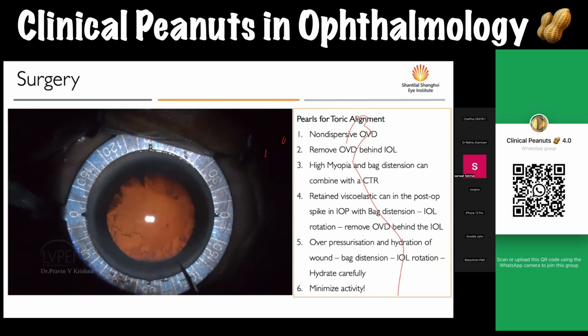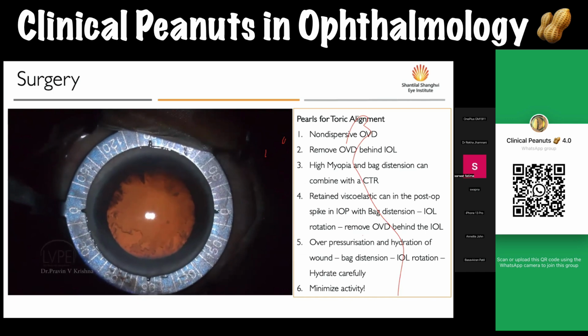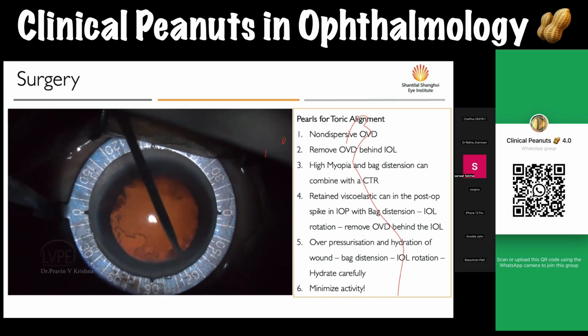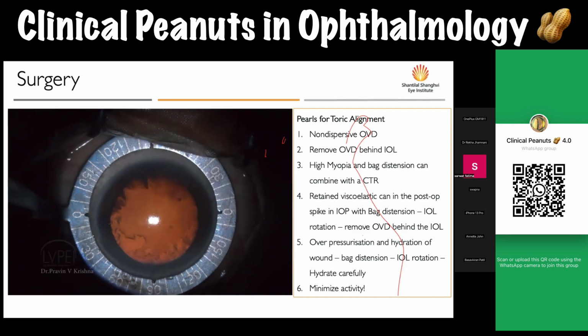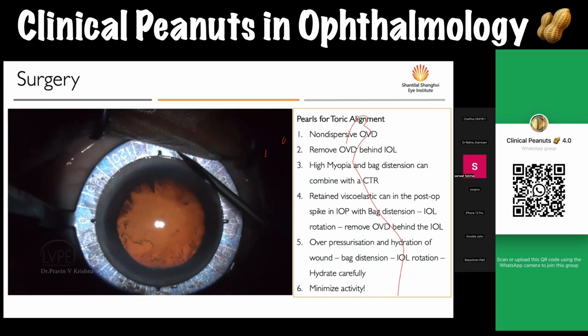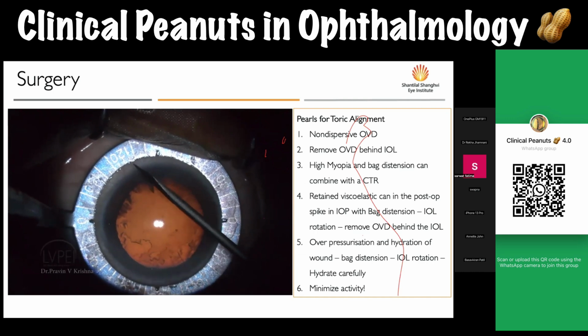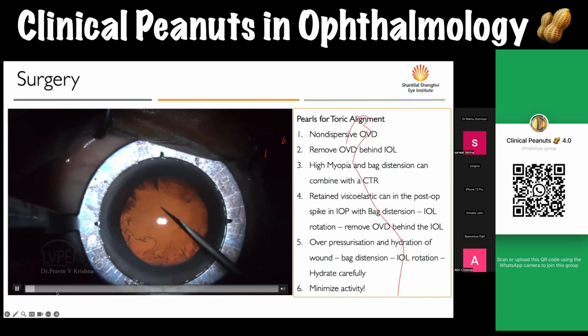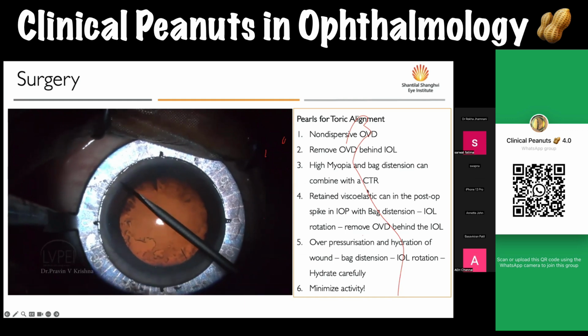Dr. PVK here has already stained his MVR blade with a slight amount of ink, and because this produces a very narrow, thin profile, he's using it to mark the two opposite sides of where the lens should be placed.